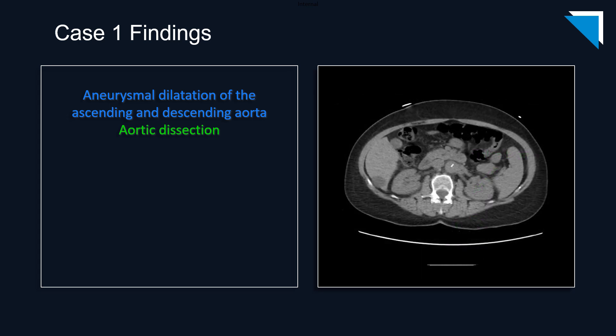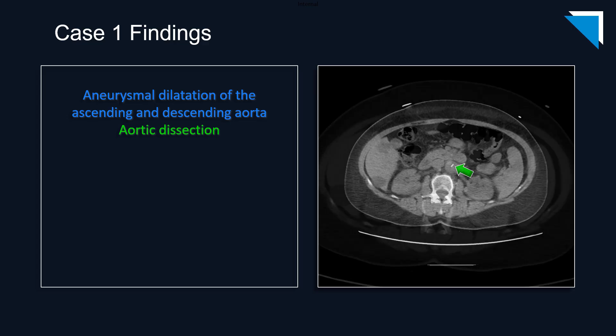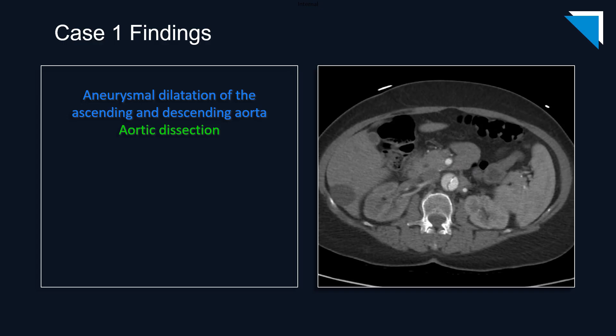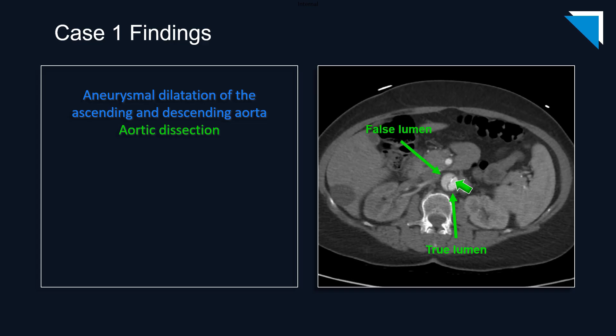This non-contrast axial image at the level of the descending abdominal aorta reveals another focus of displaced intimal calcium, which is again visible in association with the dissection flap on the post-contrast images. Here again, we can see the true lumen of the dissection. At this level, it is on the left posterolateral aspect of the aorta, with the false lumen being slightly less opacified along the right anterolateral aspect of the aorta.